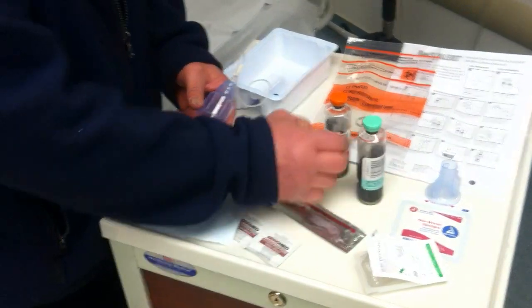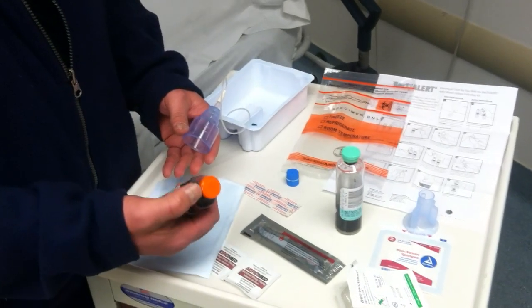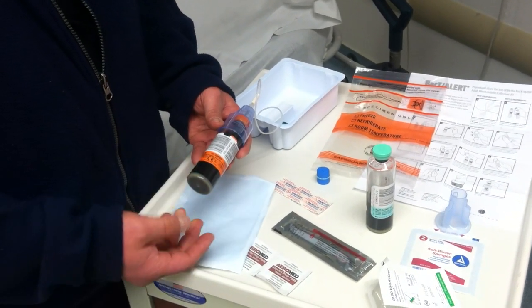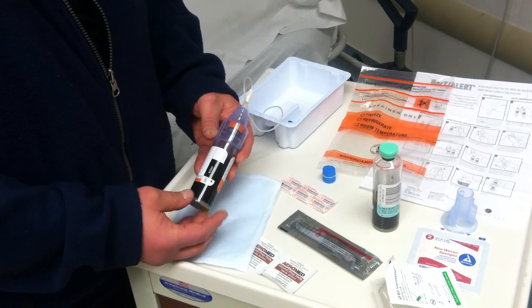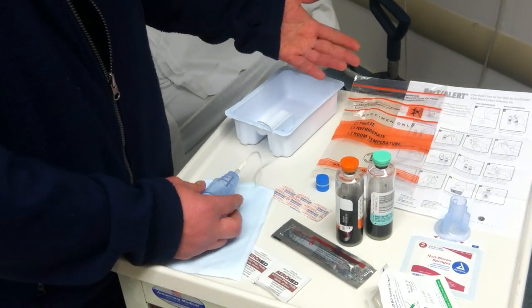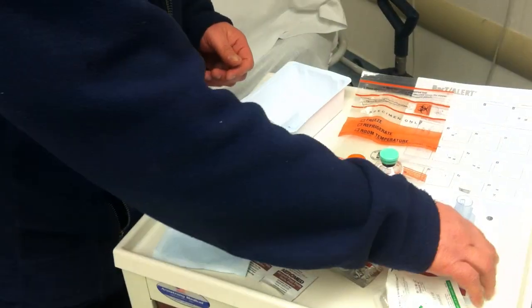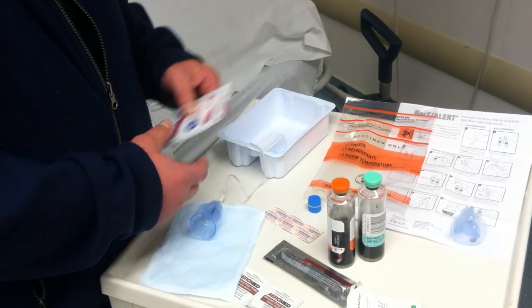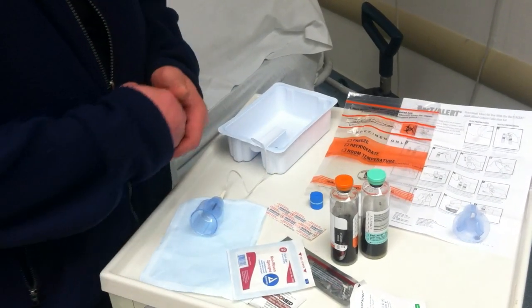You can mix it a little, and then we go for the anaerobic bottle, removing the top and inserting it in the same way, collecting 5 mLs of sample. We're going to swirl, remove the tourniquet, have a 2x2 gauze ready, tamp out of the site, and then use a band-aid to secure.